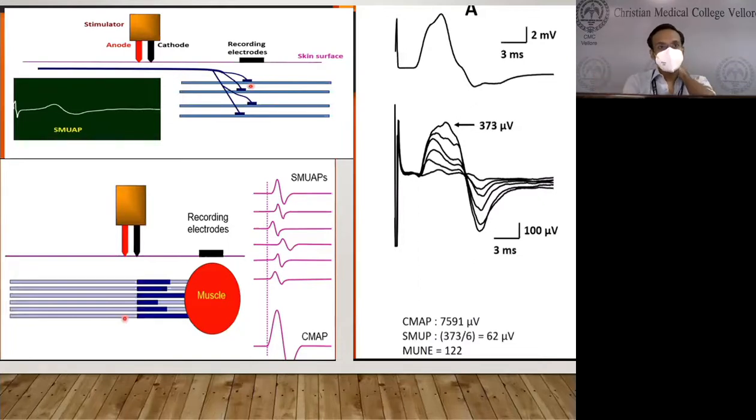So this is our lab EMG, I have not done it. I've seen that all these things are there in the commercial EMG machines, even the old ones. Now, it is quite impractical to do all these things, so they have automated it. Instead of doing 9, they take up to 500 incremental stimulations, which is automated. The machine itself has an algorithm for doing it.